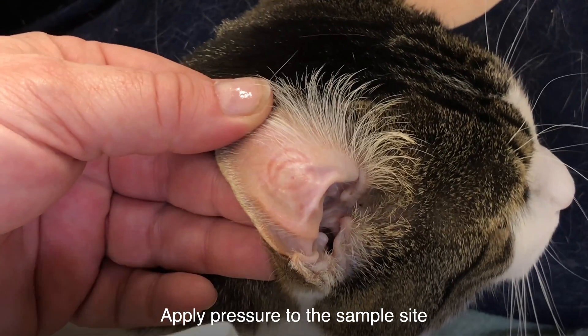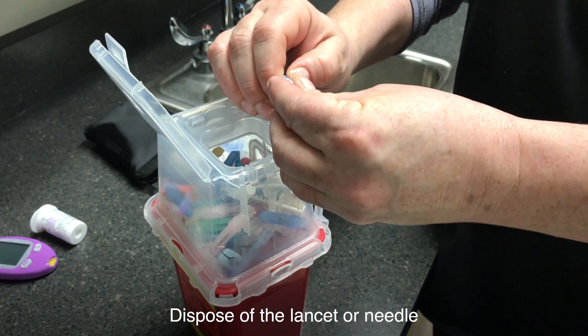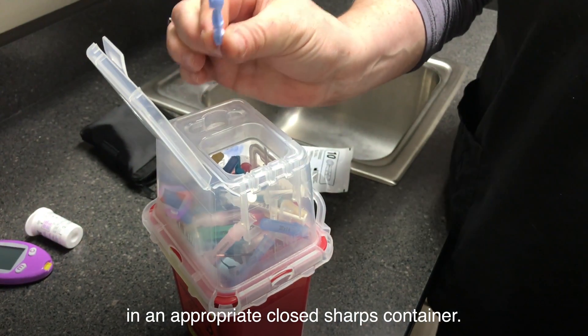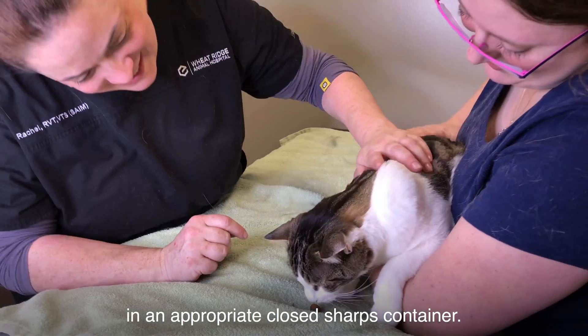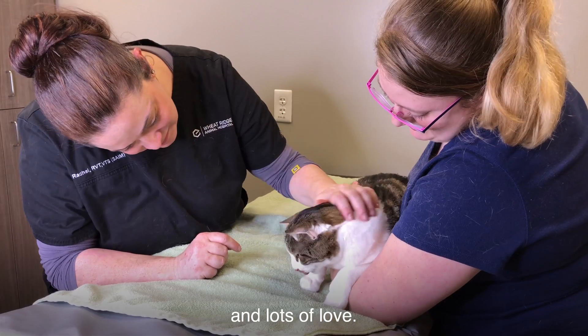Apply pressure to the sample site with a cotton ball or a piece of gauze. Dispose of the lancet or needle in an appropriate closed sharps container. It's time to celebrate! You did it! Give your pet a low carbohydrate treat and lots of love.